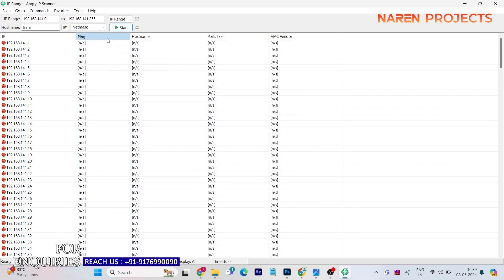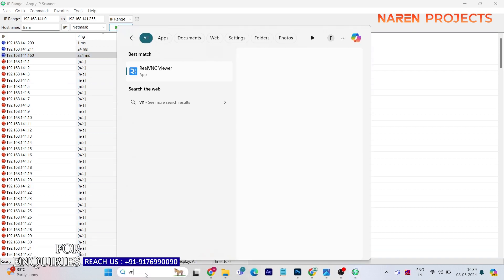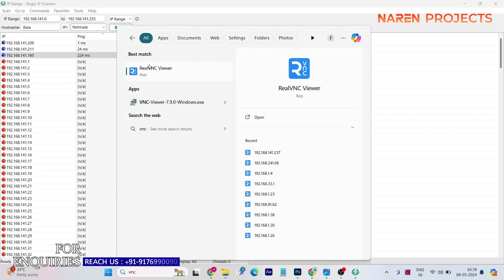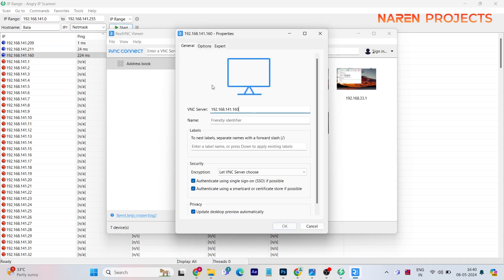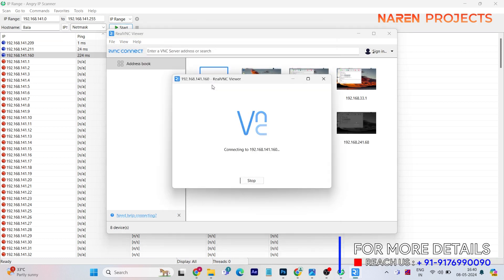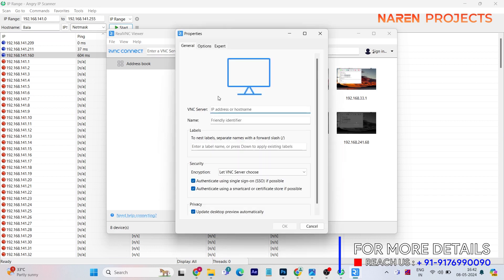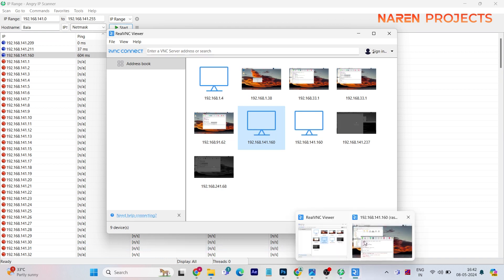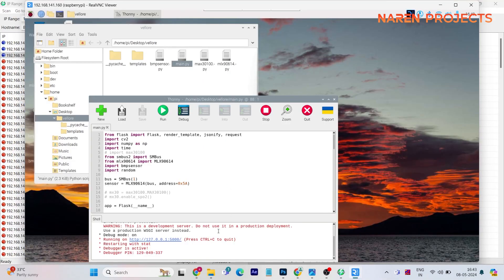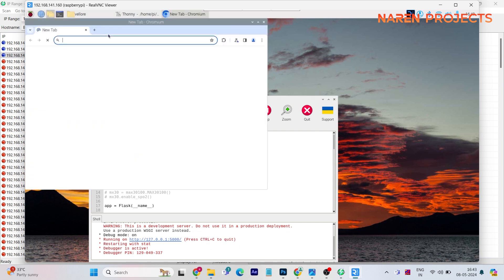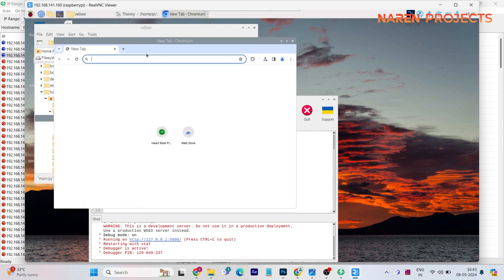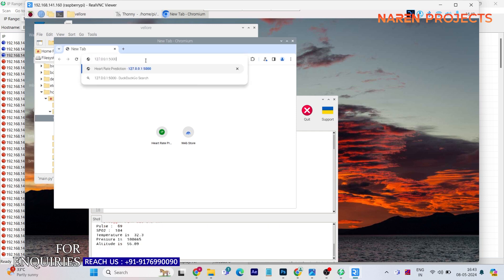So in the demonstration, now I'm taking the VNC of the Raspberry Pi. So this is the Raspberry Pi window. I opened the code using Thonny environment. The complete application is web-based, so the localhost URL will be the IoT part. This is the IoT part, you can see.